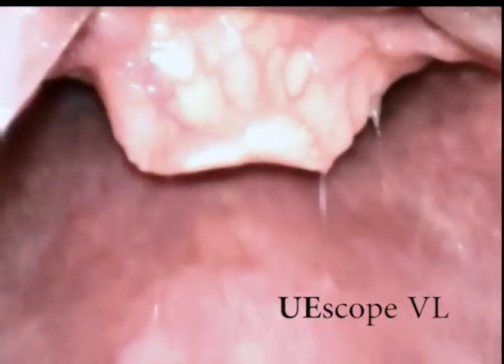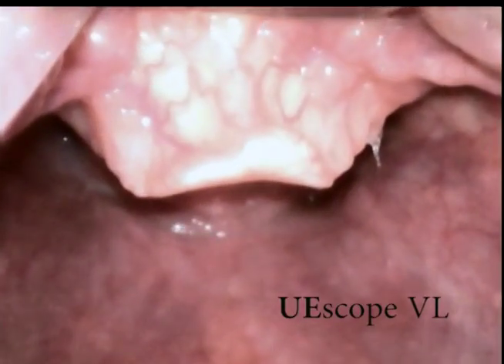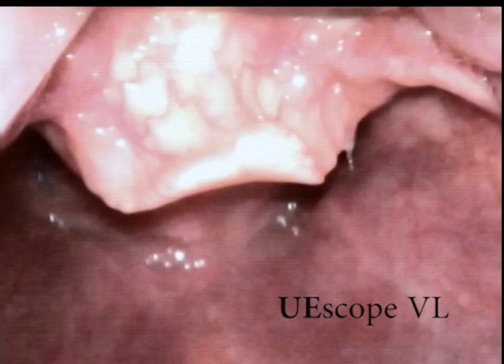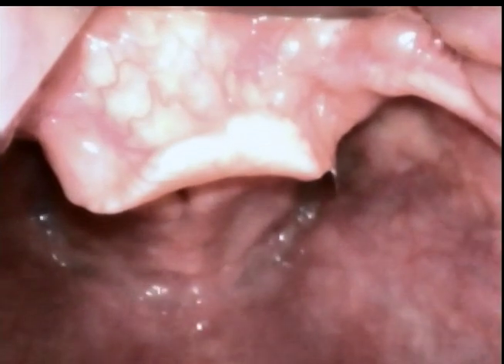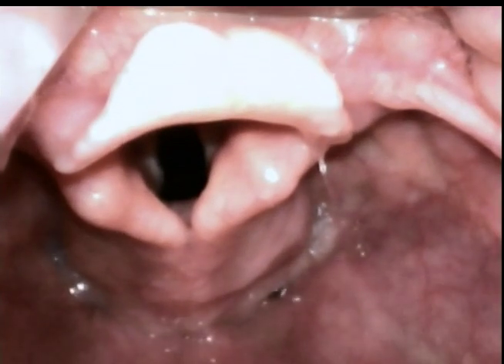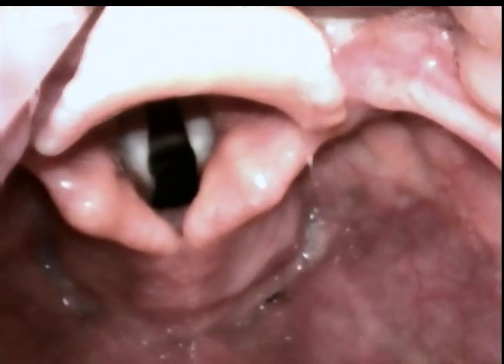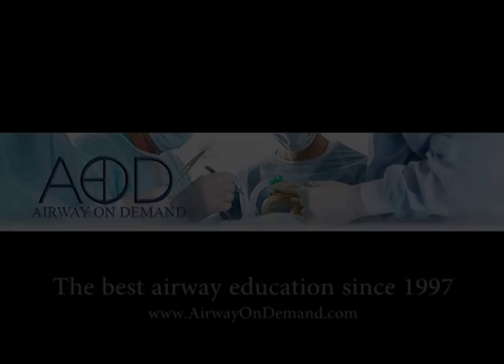Richard Levitan, in his teaching and writing, emphasizes the technique of epiglottoscopy, where the operator carefully identifies the superior and anterior anatomy down to the level of the epiglottis. At this point, it can be assured that the larynx will be found in a more posterior and caudad position. So, let's take a look at the larynx.